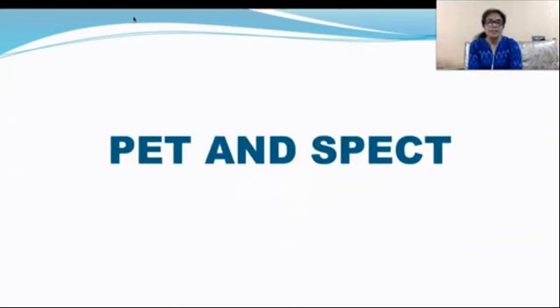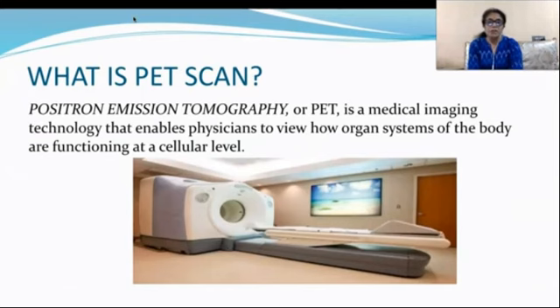Now PET and SPECT. What is positron emission tomography and single photon emission computed tomography? Positron emission tomography, or PET, is a medical imaging technology that enables physicians to view how organ systems of the body are functioning at a cellular level.